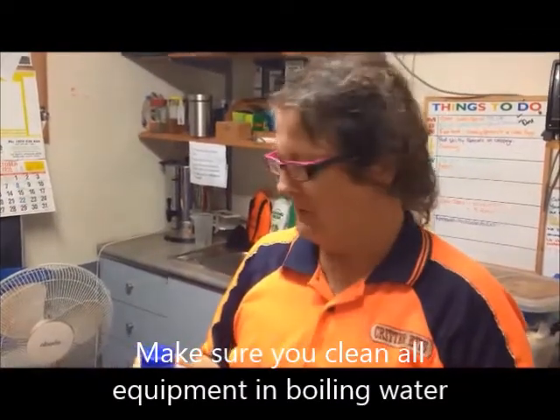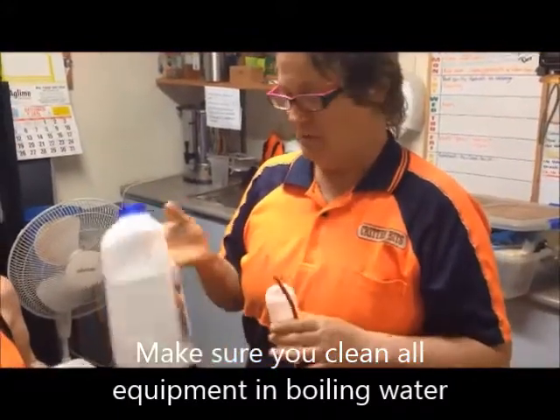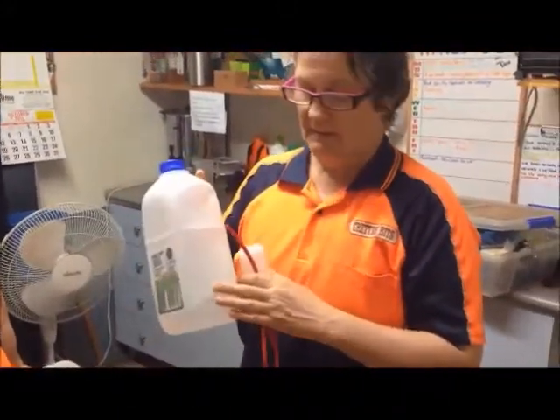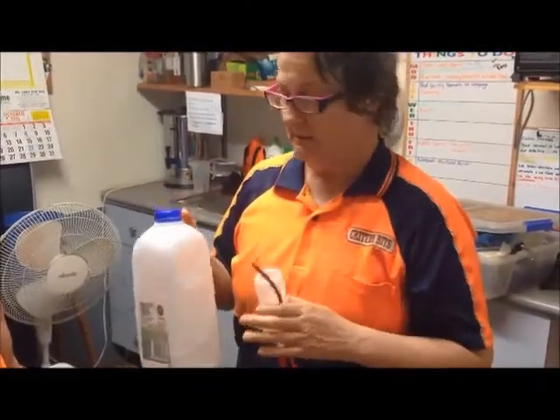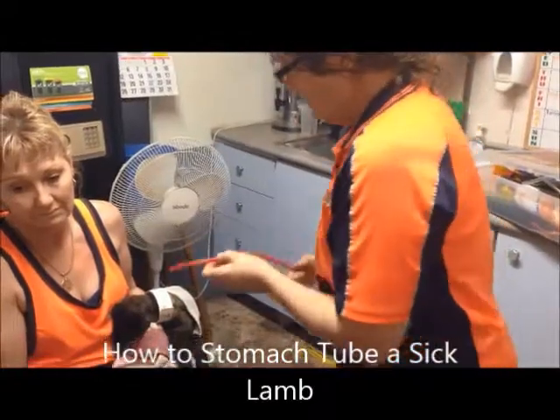The lamb I was speaking about earlier — I've decided to bring it up. The weather is pretty bad at the moment, so we're going to give it a stomach tube with some warm electrolyte. It's really easy to do and I recommend it when your lamb gets very weak like that. So first of all, you get his mouth.